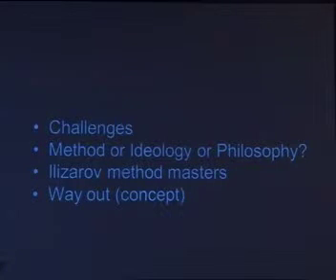And what is very important? What is the Ilizarov method? It's a method, it's a kind of ideology, or a kind of philosophy. And we will speak about people who use the Ilizarov method, and it's very important too. And we will speak a little bit about concepts, about our days, and about the near future.